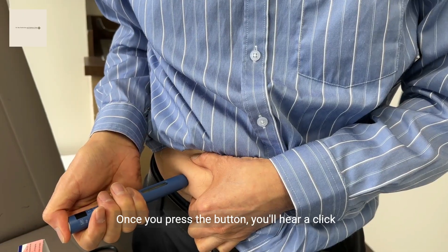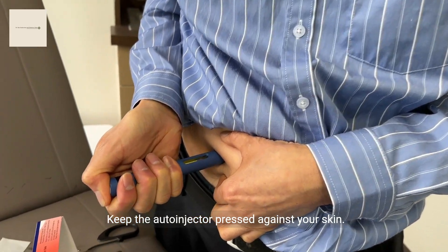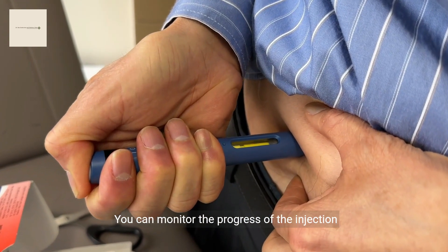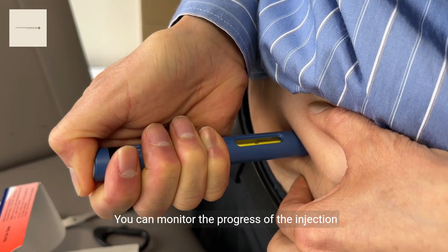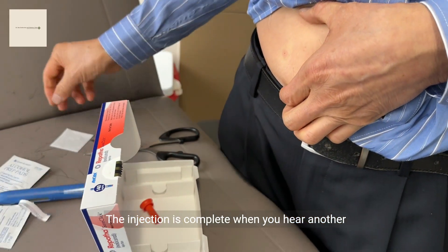Once you press the button, you'll hear a click signaling the start of the injection. Keep the auto-injector pressed against your skin and monitor the progress through the medication window. The injection is complete when you hear another click.